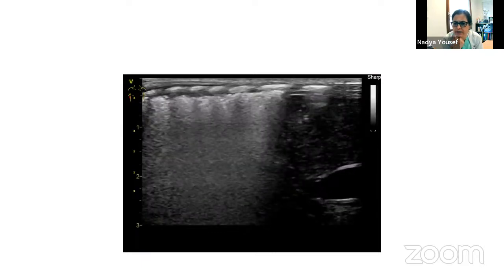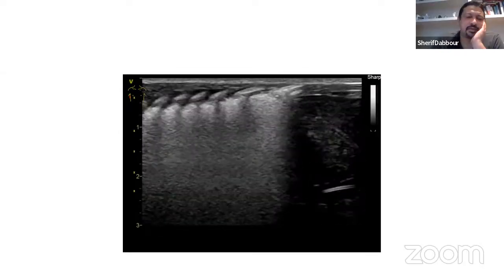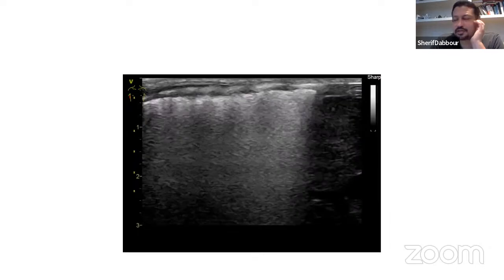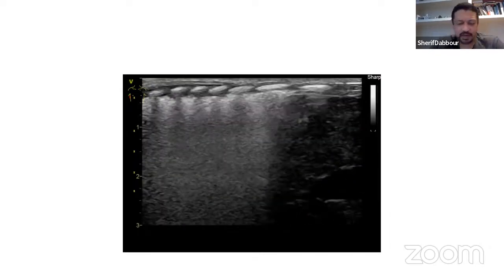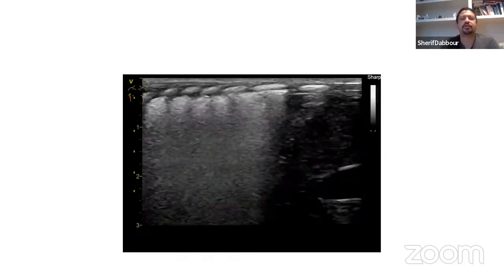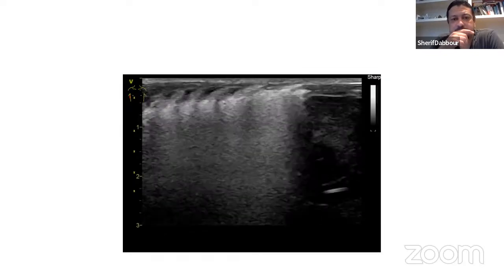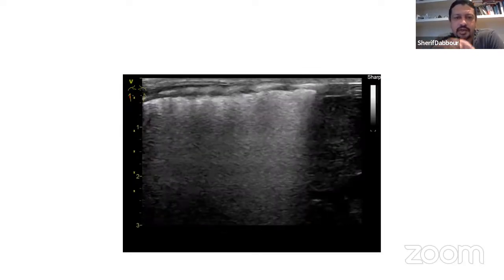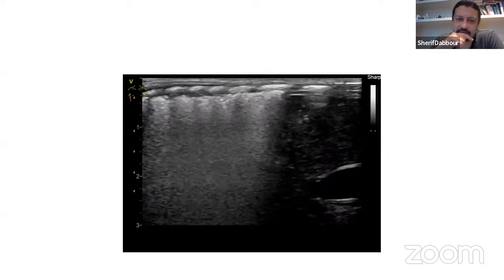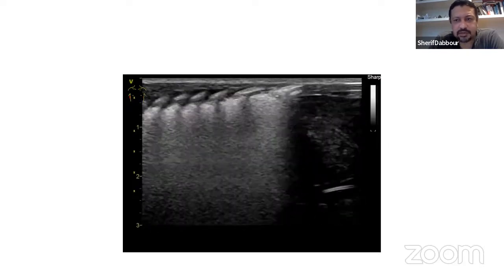Does that make sense to you with the clinical picture? Yes, because I believe the baby was extubated 2 days back. And when the baby was re-intubated again, I believe the team left the baby, who is only 550 grams, a couple of hours on high flow and then CPAP. Maybe post-extubation complications, as some areas of collapse happened. And also the X-ray showed some RDS as well. So lack of aeration could be seen and appreciated in most of the videos.